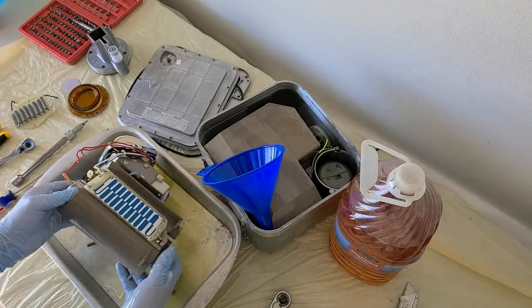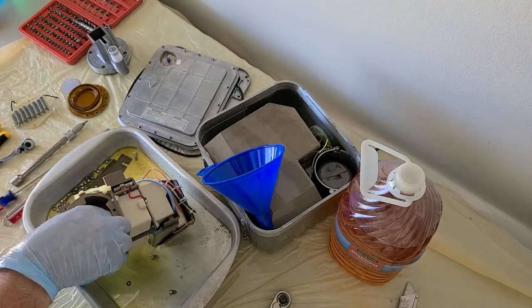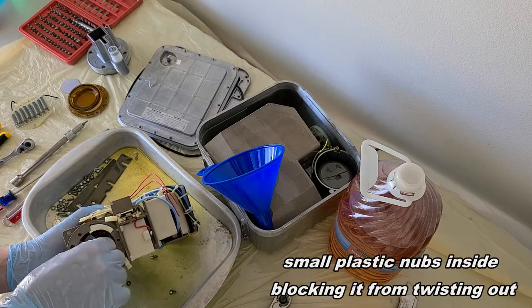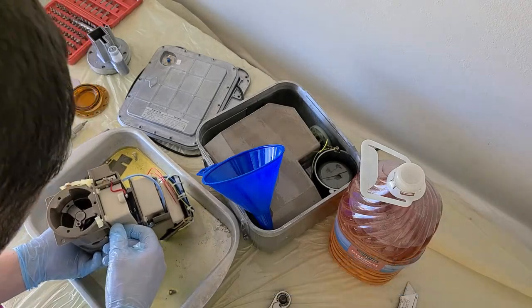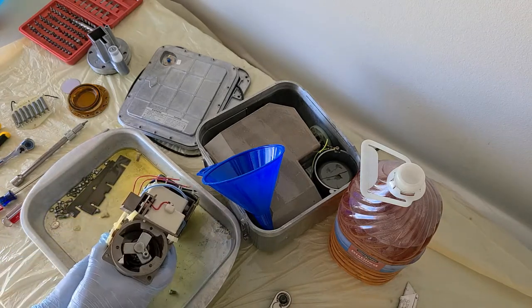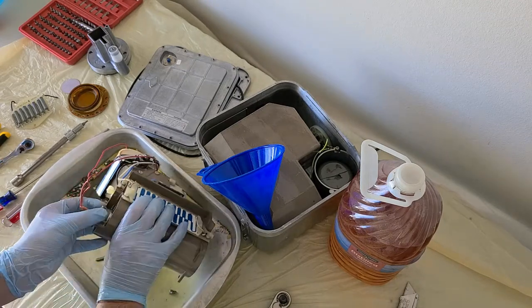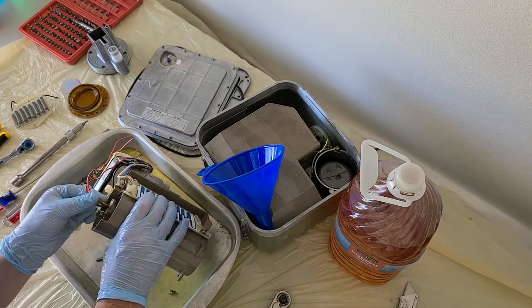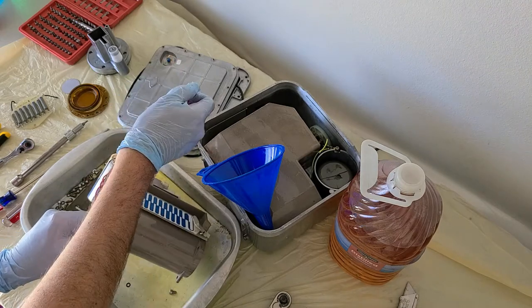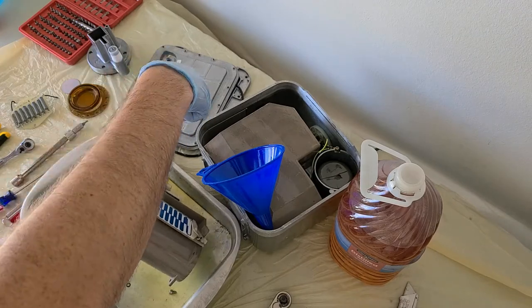Or not, it needs to. See how it's going to come out, I guess we need to rotate it. Oh, that little metal bracket in here is actually holding it from coming out. Let's go ahead and see what we can do there. There's a little lead sleeve inside of here around the tube, maybe that needs to slide out, I'm not sure.